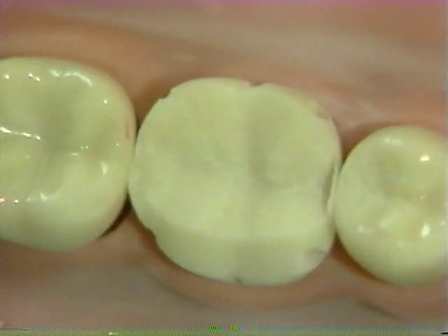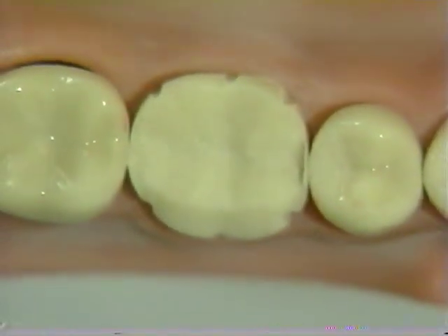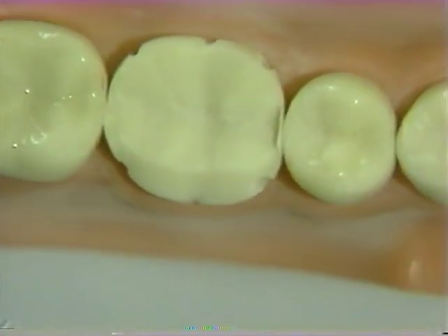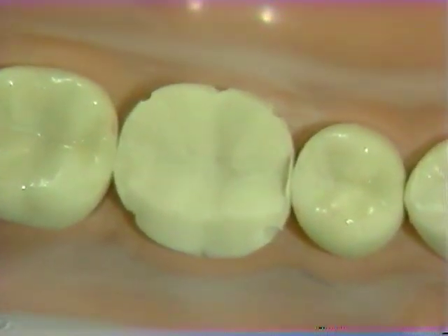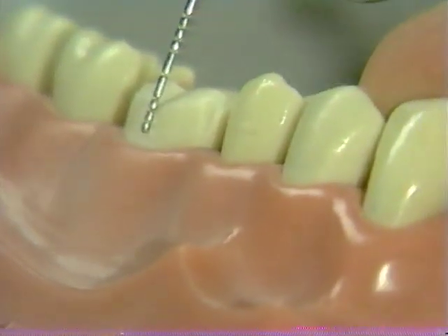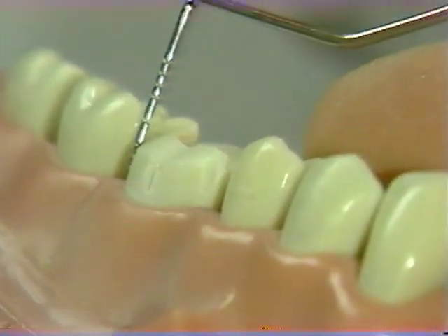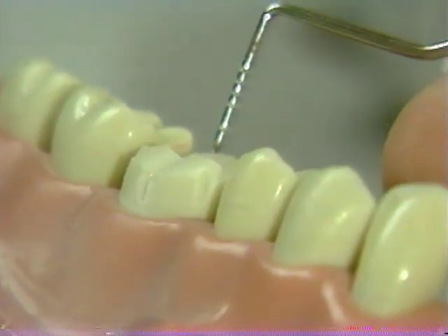Once all six depth cuts have been placed from the occlusal perspective, your tooth preparation will look like this. This is the time to correct any deficiencies in the alignment of the grooves. You may wish to use your peri-probe to verify that all grooves are parallel to one another.